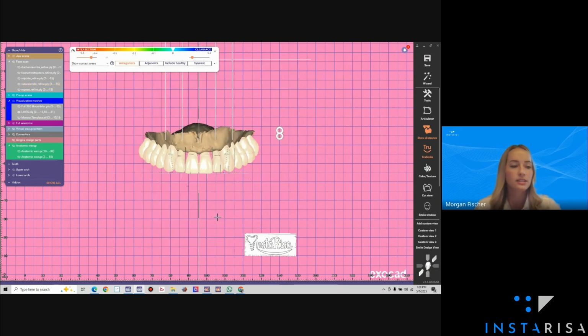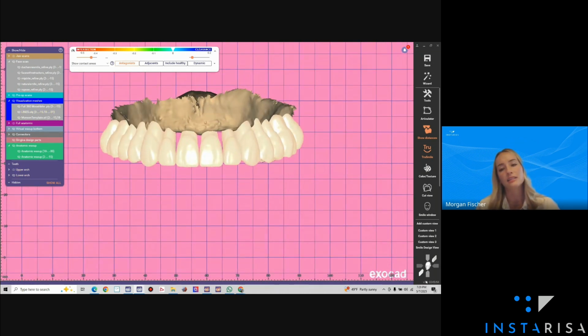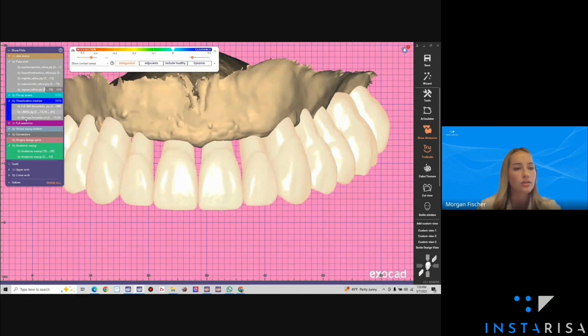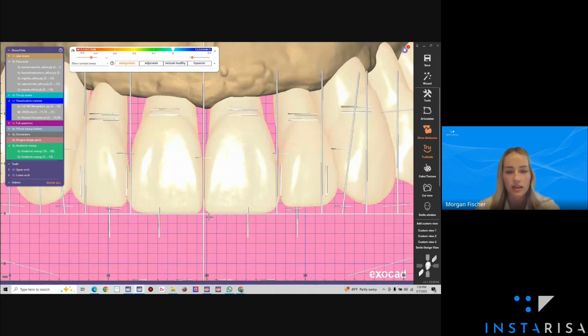So I always like what Dr. Morales says. He likes the central incisors to be like twins. They should look exactly alike. His lateral incisors are going to look a little bit more like sisters, and then the canines maybe more like cousins. So 8 and 9 are always going to be exactly the same, and I can follow that while using my lines here. So just looking at some of these, I have 8 and 9 set. My grid lines are going to follow according to Quay's principles.